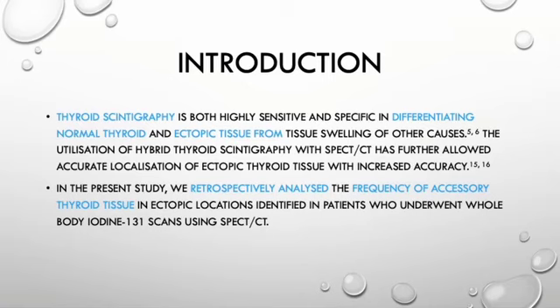Thyroid scintigraphy is considered both highly sensitive and specific in differentiating normal thyroid and ectopic thyroid from tissue swelling of other causes. The utilization of hybrid thyroid scintigraphy with SPECT CT has further allowed accurate localization of ectopic thyroid tissue with increased accuracy.